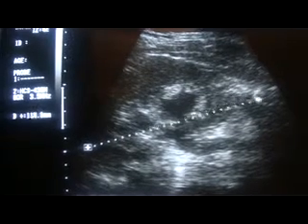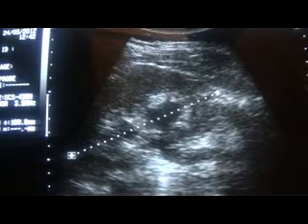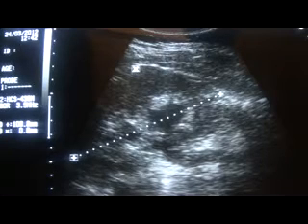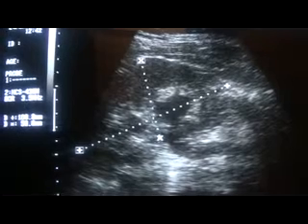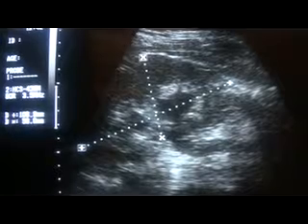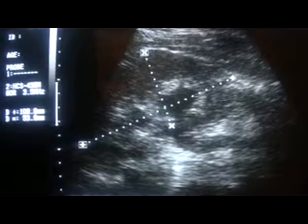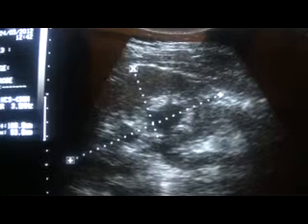and when you have to measure the kidney, and the kidney is hydronephrotic, try to measure from the prone position. It will give you a better depth. Now in the previous view, we were getting the anterior-posterior diameter of more than 5, whereas from prone position we get the anterior-posterior diameter of the left kidney 4.8. Now 5.3 is more than expected normal, because 5 centimeters is the upper limit, 4.8 is normal.